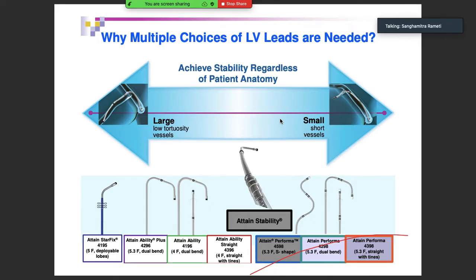Yes, sir. I have seen one case, sir, with severe LV dysfunction with LVDT. Patient was asymptomatic. Later, she developed an episode of syncope, and we got that case admitted. Okay. And we are planning now for the CRT. So now my one question. When are CRTs normally implanted for a left bundle branch block patient? In a patient with right bundle branch block, when do you implant a CRT?